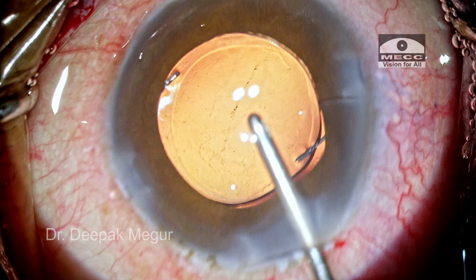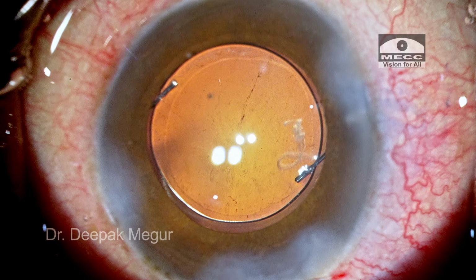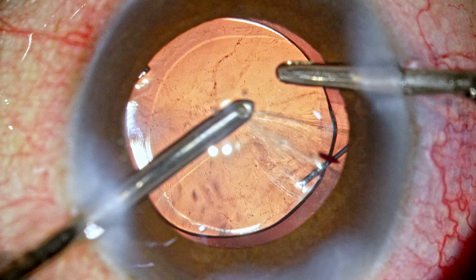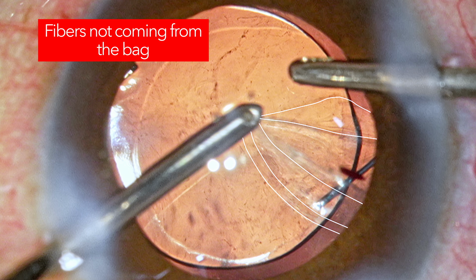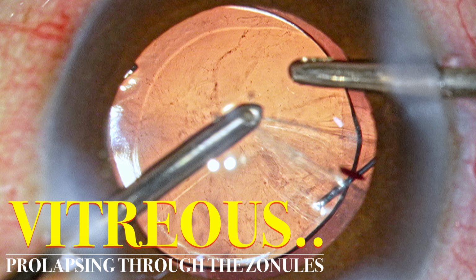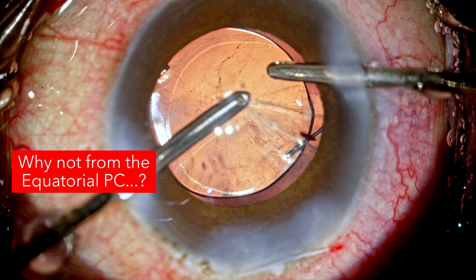I'm trying to remove the OVD, and as I'm doing that, I feel that there is some amount of cortical fiber here. I'm just trying to aspirate it, and then I realize something is abnormal. These fibers are not coming from within the bag, but from around the bag. Well, this was a surprise. This was nothing but vitreous prolapsing from the zonules. Well, why not from the equatorial PC?